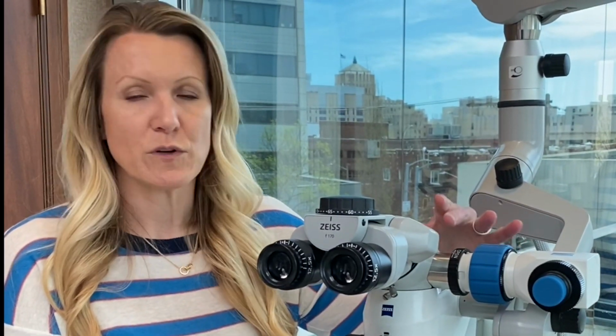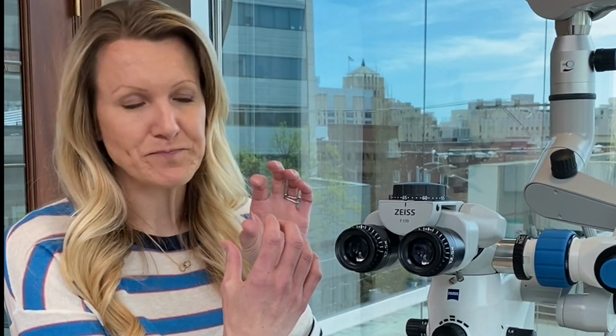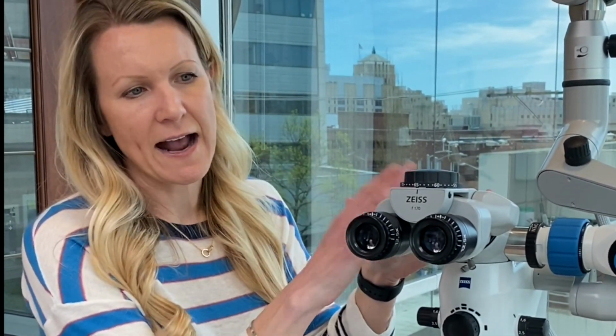The other reason that you would use a beam splitter is so that you could attach a second set of binoculars off on this side. This would be for the assistant. So assistant side binoculars, they add a little more weight to the camera and to the scope, but they're very handy. They allow the assistant to see exactly what the operator is seeing through the objective lens. And this is great for endodontics, any fine little procedures at very high magnification with not a lot of movement of the scope. You can imagine that allows the assistant to be prepared and actually hand instruments over and to support the procedure a little bit more.